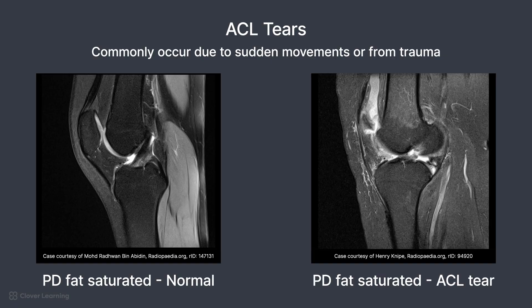On the first image, you can see the dark ACL fully intact. On the second image, you can see a complete tear with a wavy discontinuous ligament and surrounding edema.